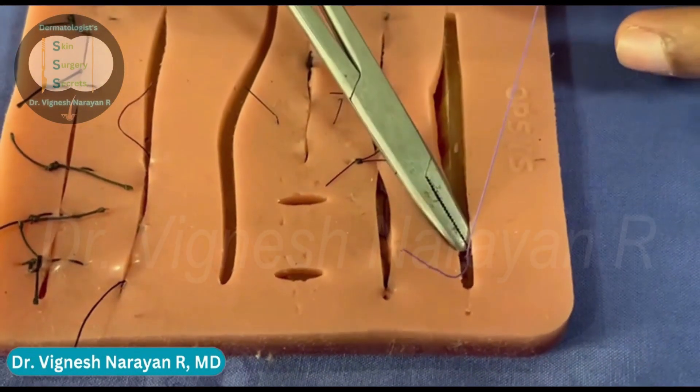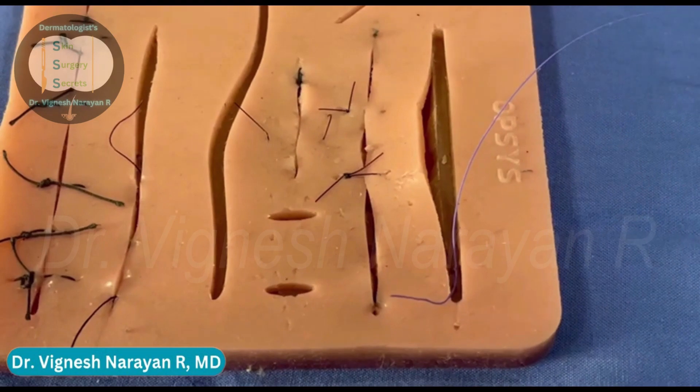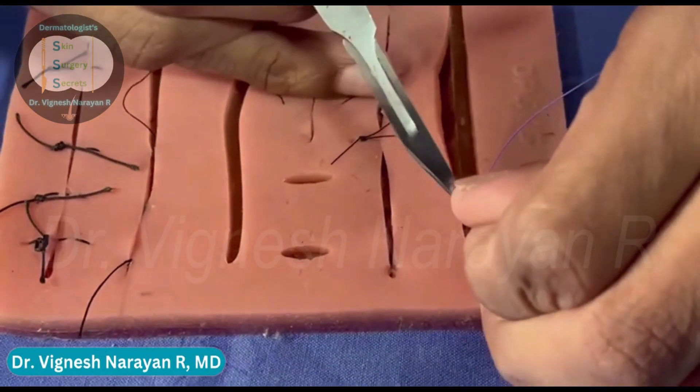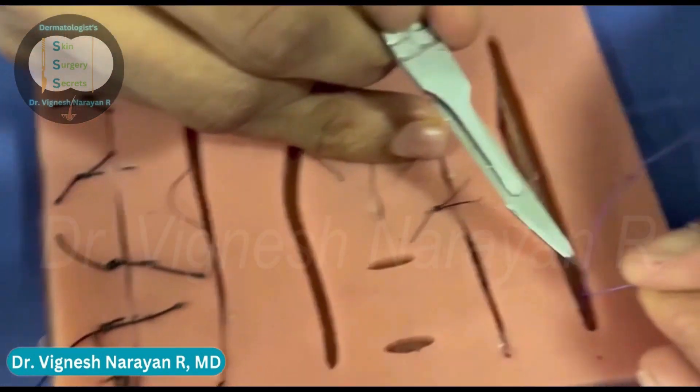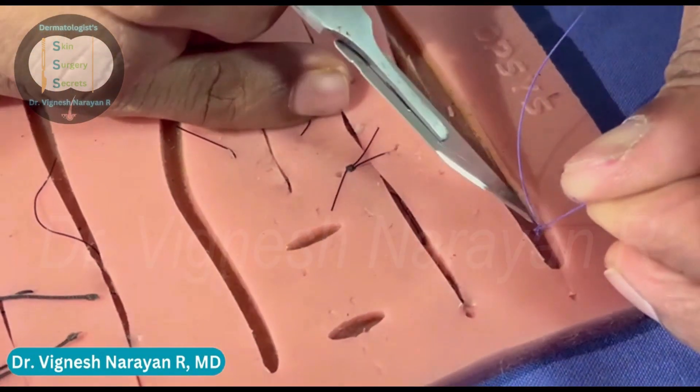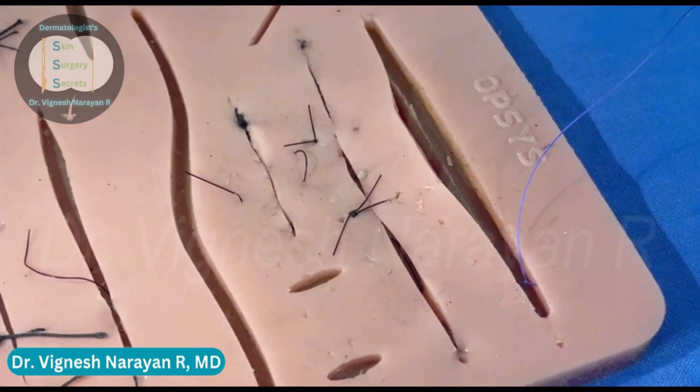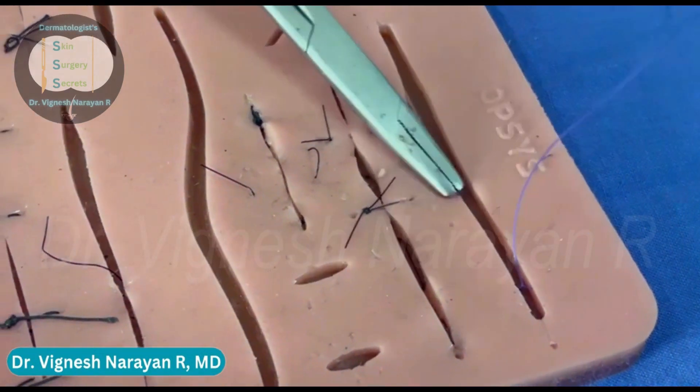Now I'm going to cut the short end of the thread. My suture material is now anchored to the subcutaneous tissue.